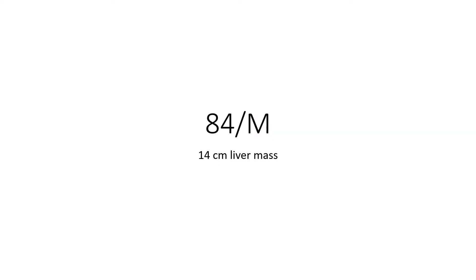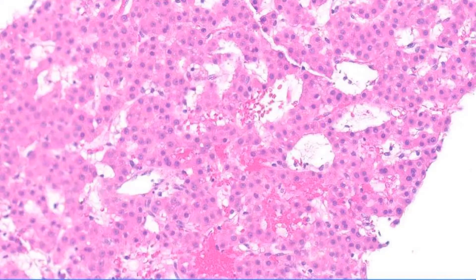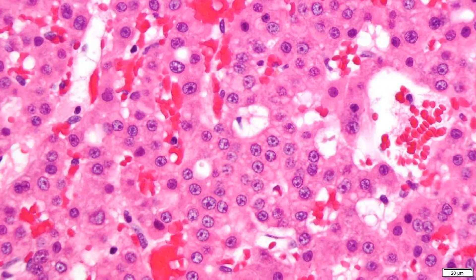Let's look at a few cases. This 84-year-old man — remember, if you have a large mass in an 84-year-old man, by definition this is more likely to be an HCC than anything else. At low power there is no background non-neoplastic liver, which is a disadvantage. At higher power this certainly looks crowded, but I have no normal liver to compare it with. It looks monotonous and concerning, and now I'm seeing a lot of pseudogland formation, so I'm even more concerned.